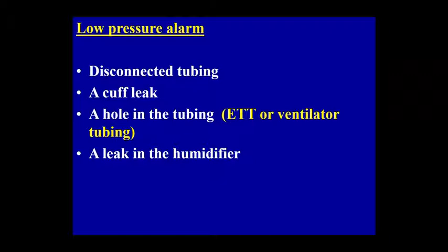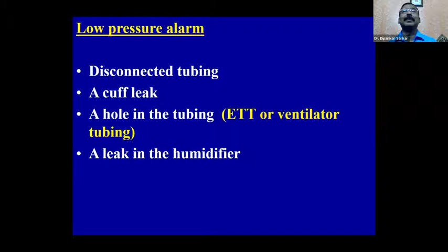Once you are confirmed there is no cuff leak, check for a disconnection. If there is a disconnection, these are the two things you can settle without the help of the medical team. But if the cuff is constantly leaking, you have to change it. Or there may be a change in the humidifier or in any part of the connection.